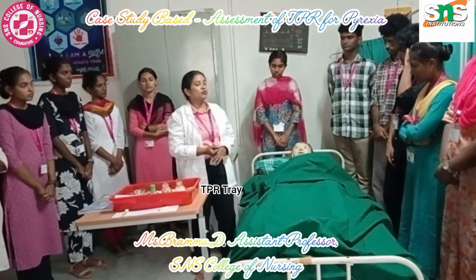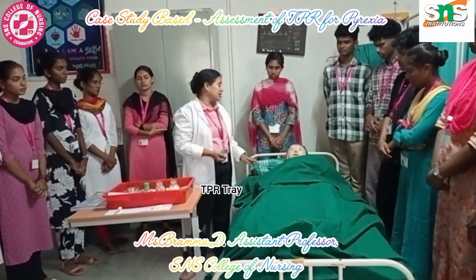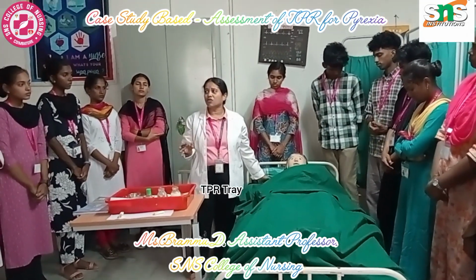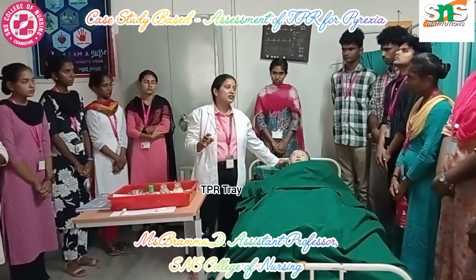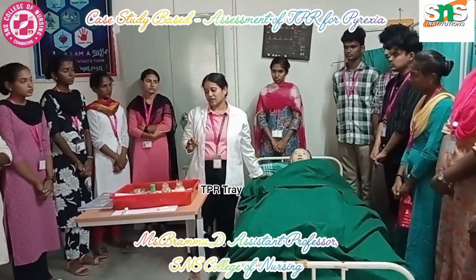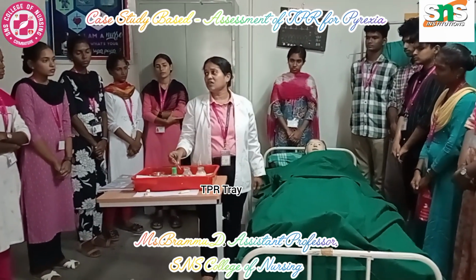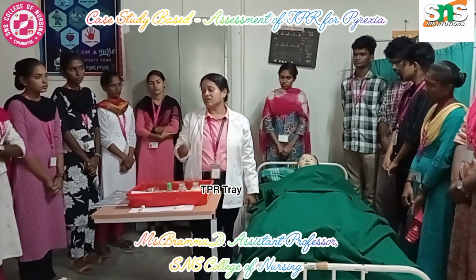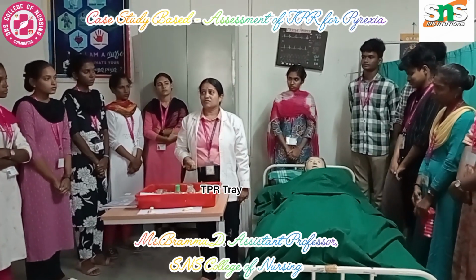This is how you have to assess the temperature, pulse and respiration. In case you are going to assess orally, see that the patient is not taking anything hot or cold 15 to 30 minutes before the procedure. If they have consumed any hot or cold beverage, please use the axillary technique. And if it is rectal, don't forget to use the lubricating jelly.